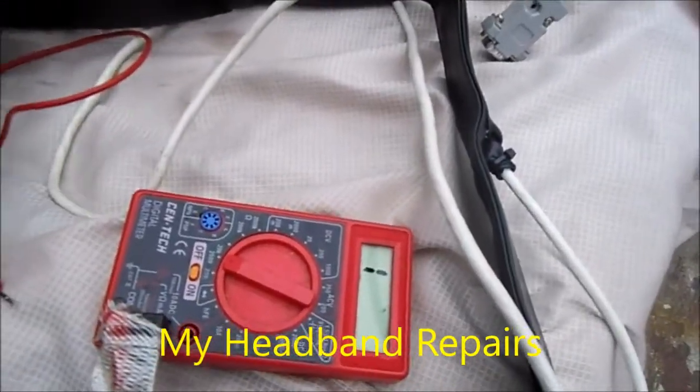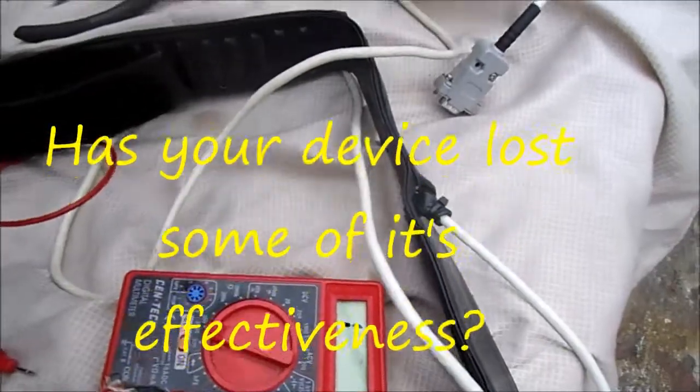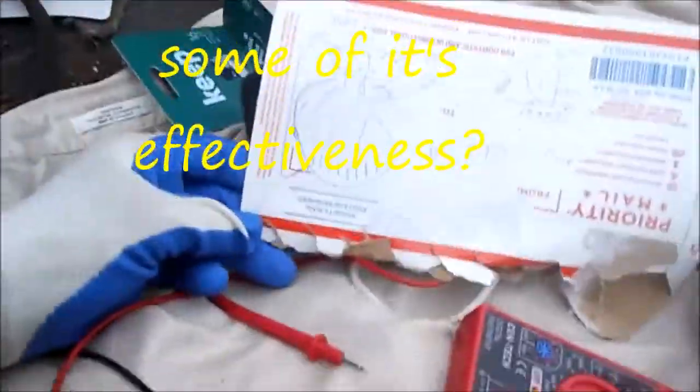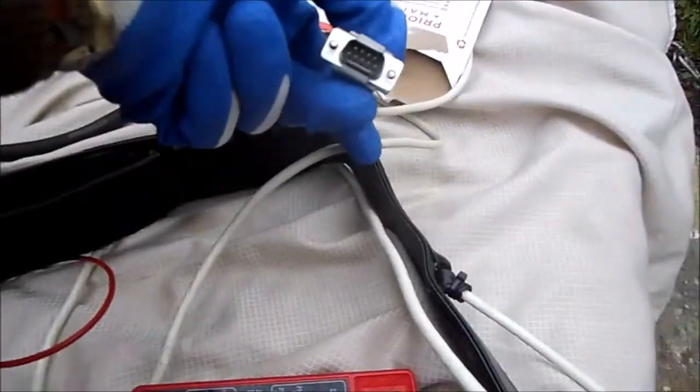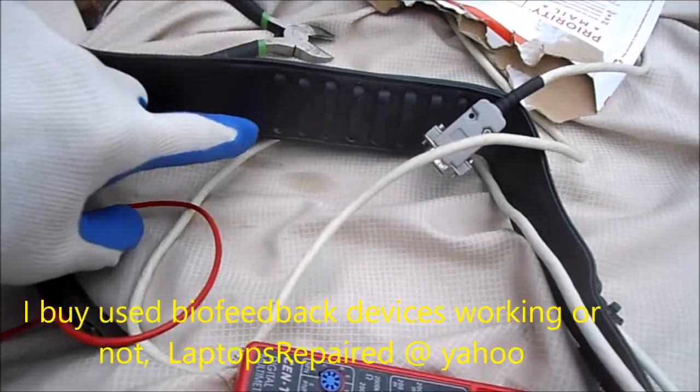You can see that what I did, I was taking some readings off of it with my meter here, and I found that there were two shorted lines. So basically, two of these terminals went to one electrode.